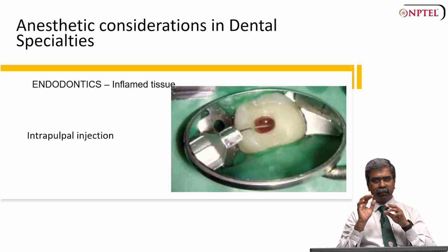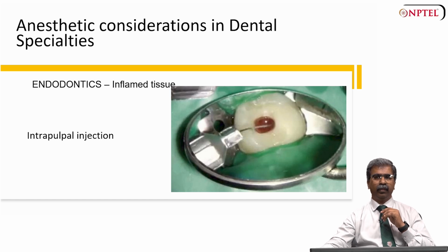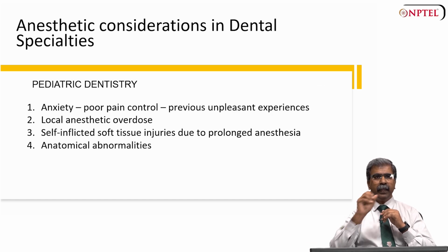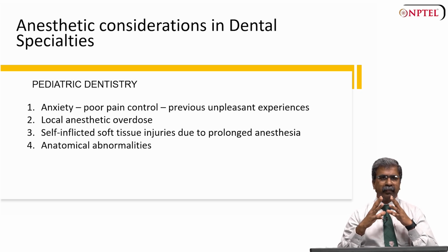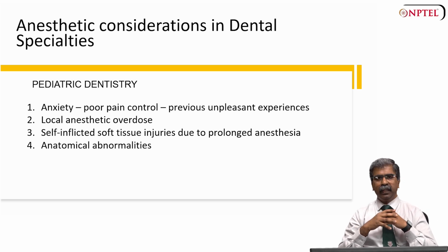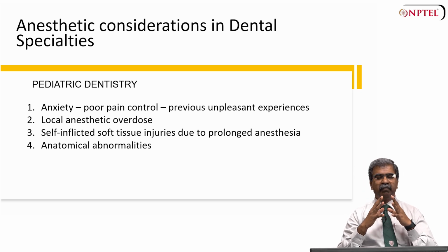Wait for 30 seconds, press it firmly into the pulpal floor, wait for 2 or 3 minutes till you achieve the local anesthesia, and use a slow speed, high torque handpiece to reach the pulp. That is again a very important point to note. In pediatric dentistry, as you know, anxiety, poor pain control, or a previous unpleasant experience will not allow the child to be cooperative.